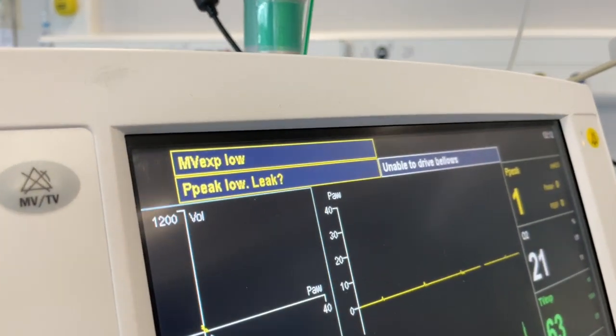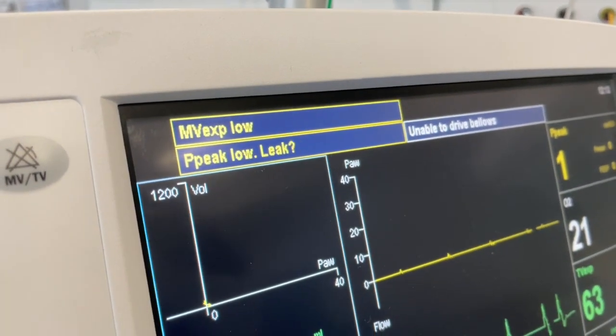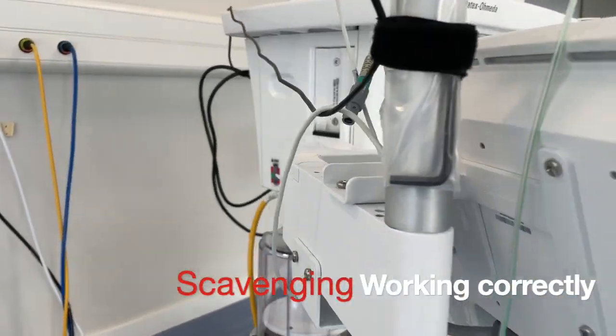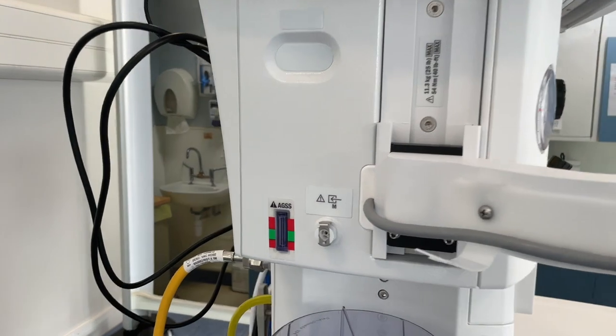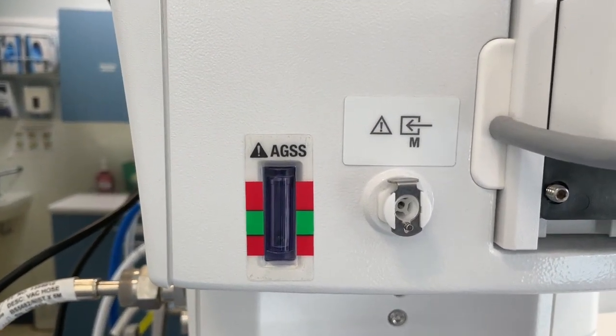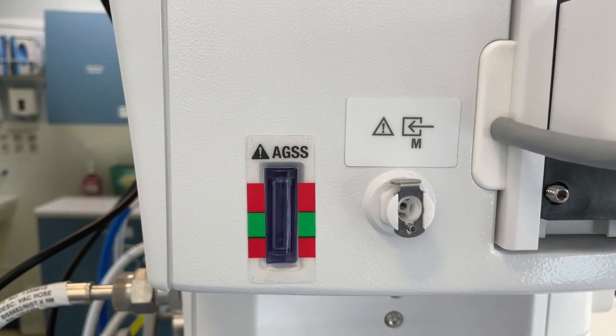Once this is complete, flick the switch back for spontaneous breathing. If the scavenging is working correctly, the ball will be floating in the green section between the two red lines. Please note, in this example the scavenging is turned off.